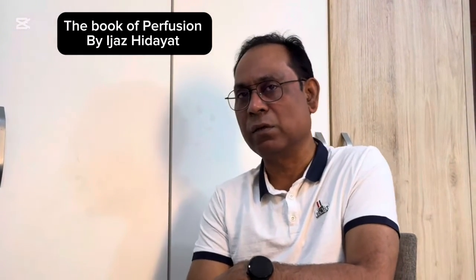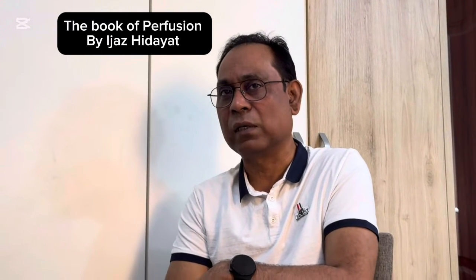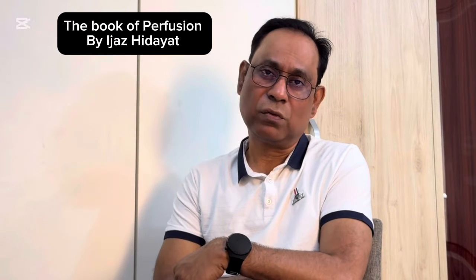Number one, we'll talk about the cannulations. In Marfan syndrome, we do not cannulate routinely in the aorta, and why not the aorta? Because there is a dissection or aneurysm, and it can cause more trauma if you cannulate the ascending aorta. So the preferred arterial cannulation is either the axillary or the femoral artery, which helps to prevent that.